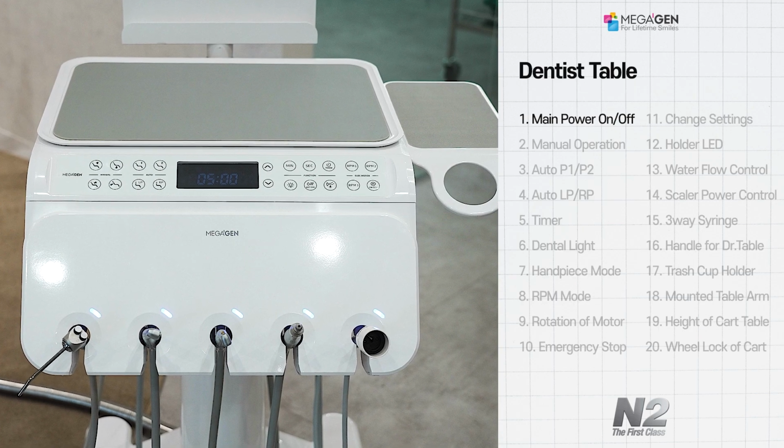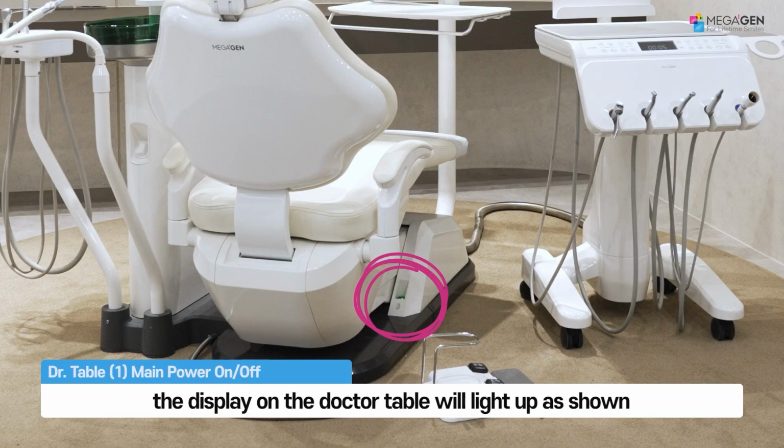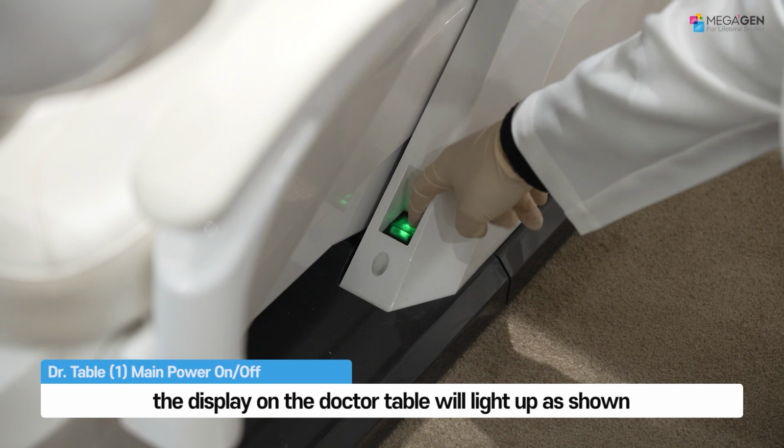How to use the dentist table. First, when you turn on the chair's main power, the display on the doctor table will light up as shown.